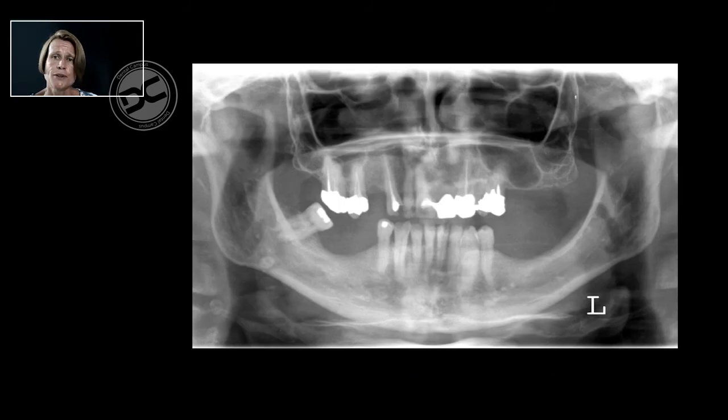One more important point to consider why cone beam CT could be justified in implant dentistry is the fact that we also deal with anatomy and vital neurovascular structures. If, for example, we take this patient, we see that he is in need of posterior implant placement, and thus we need to identify the mandibular canal as well as the mental foramina.